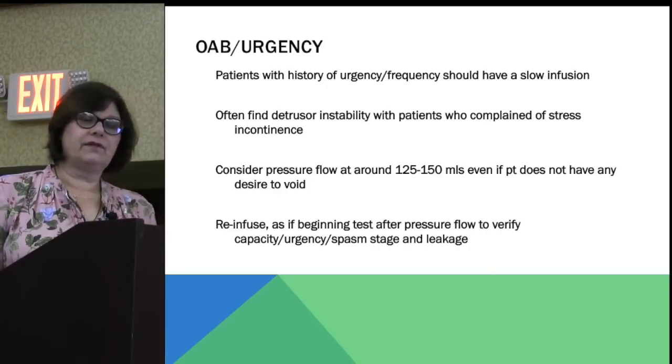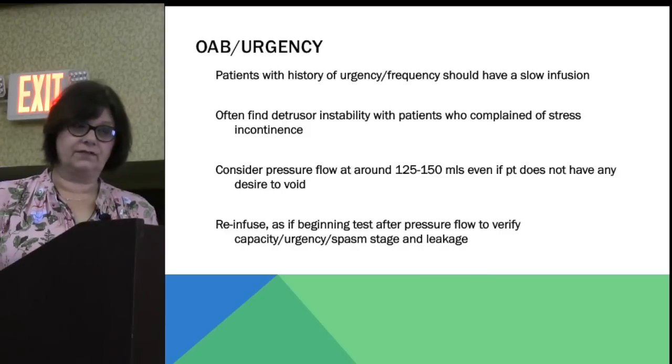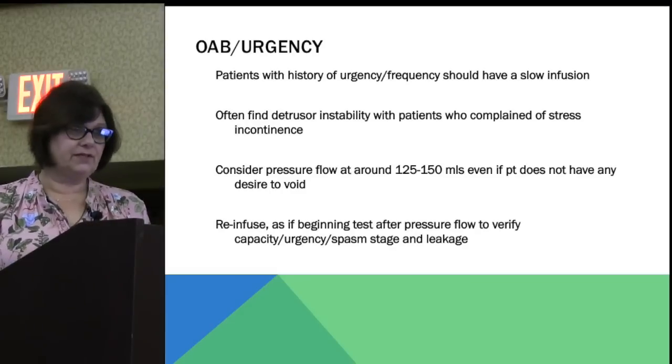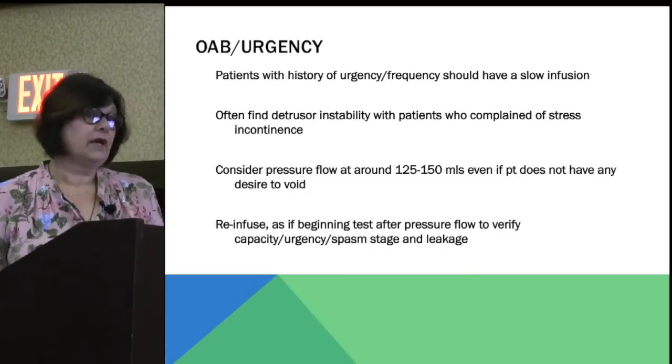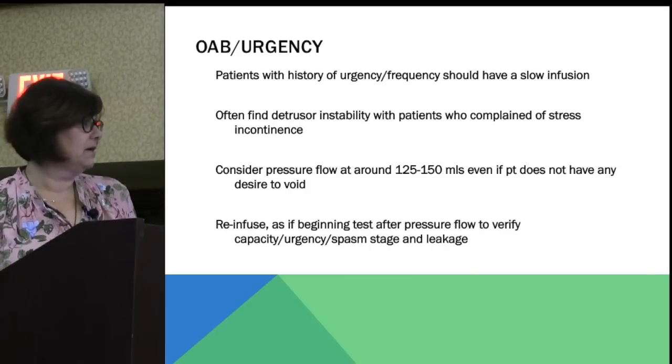And stress incontinence also, the other thing is positional. If you've got the patient laying on the table and they swear they have stress incontinence, you're not getting anything, have them stand up. I have patients stand up all the time to do their stress testing, and more often than not, they will end up leaking, because that's what they say. I only leak when I stand up.